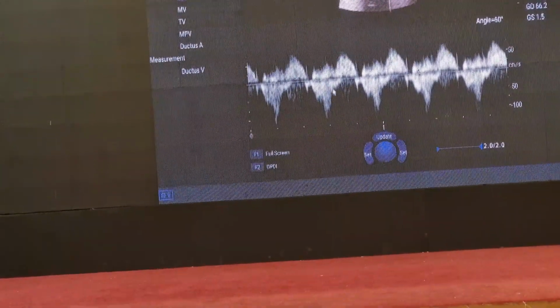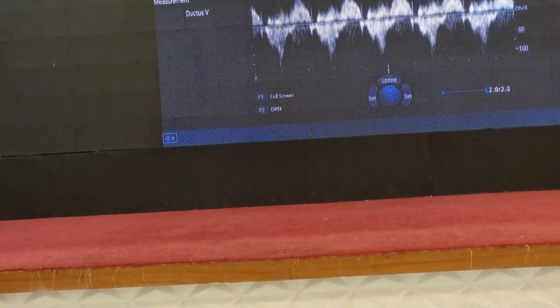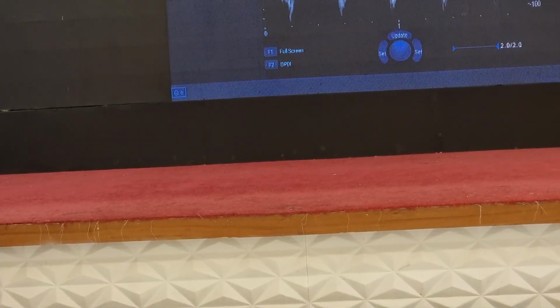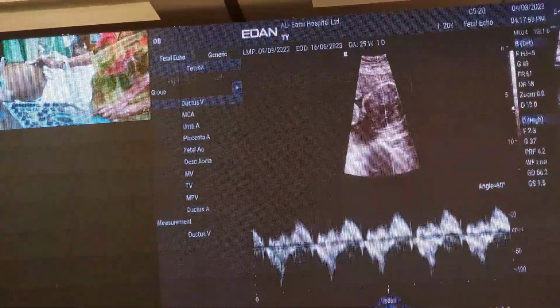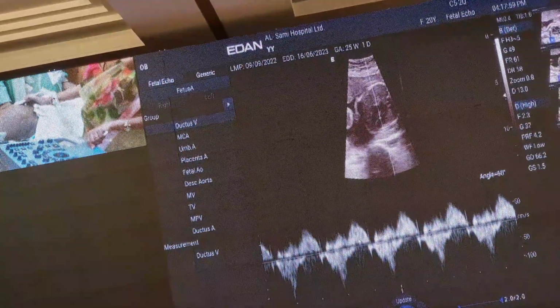and this is the ventricular contraction. So if you look at this waveform, every atrial contraction is followed by a ventricular contraction. In other words, the rhythm of the heart is normal. So this is a very good way of figuring out the rhythm of the heart. If you get this waveform, the rhythm is normal. Now, if the rhythm is abnormal, then it's a huge big thing. There is a lot more to be done, which we can skip for now. But there's one more thing I would like to show you.